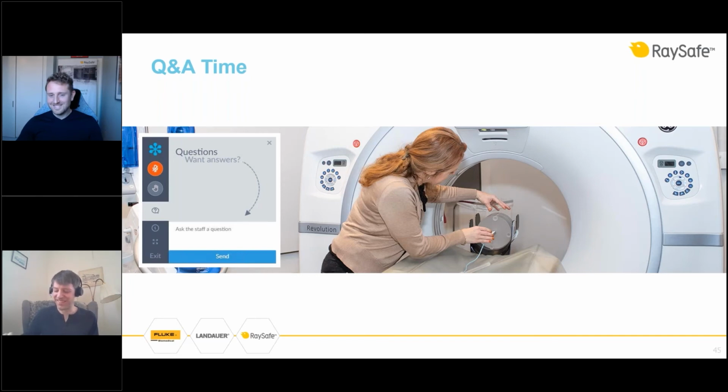Excellent. Another question where I can use my prop. Great. That's a very good question, by the way, because on modern CT machines you can have beam widths of 160 millimeters, which is not that uncommon on new fancy scanners, but here the active length is only 10 centimeters.